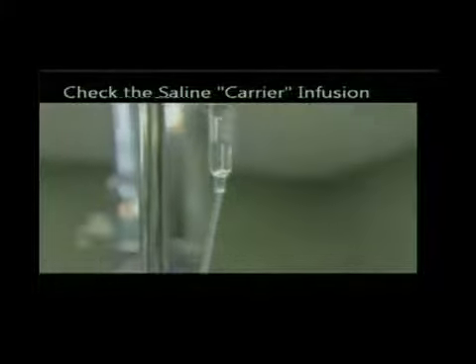And then it comes down. And then back to documentation, just to emphasize, you document, you document, you document, you write down everything. These little dots here, this is the systolic pressure. Actually that's the heart rate there. He's going to be putting in the diastolic pressure down here. These are coming in every 5 minutes. So every 5 minutes he's writing this down. What was happening during the procedure? This is a responsibility to the patient. This is also part of good care, so if there's a trend, he can see it in his own document.